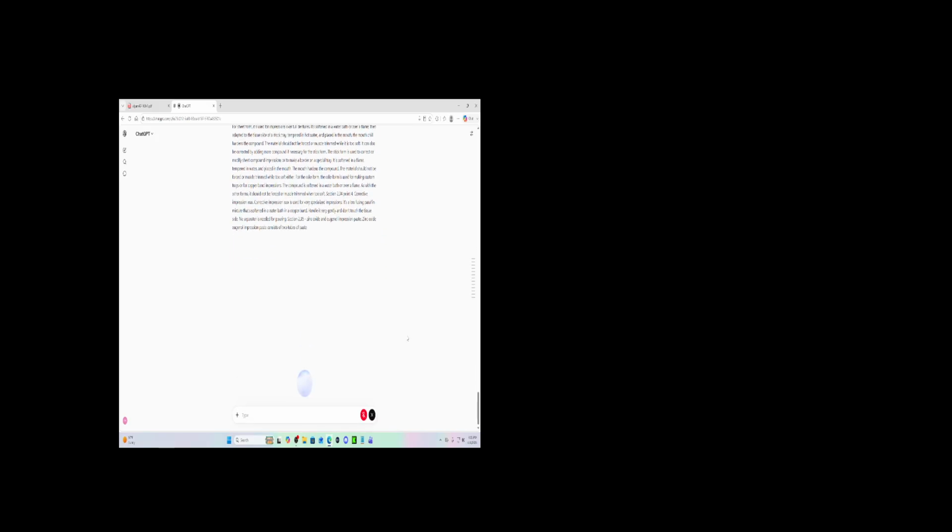Section 2.35, Zinc Oxide and Eugenol Impression Paste. Zinc oxide eugenol impression paste consists of 2 tubes of paste. It's used for final impressions of complete dentures, jaw relation records, and base plate stabilization. When the two pastes are mixed, they set to a rigid mass. The material doesn't distort and is dimensionally stable.